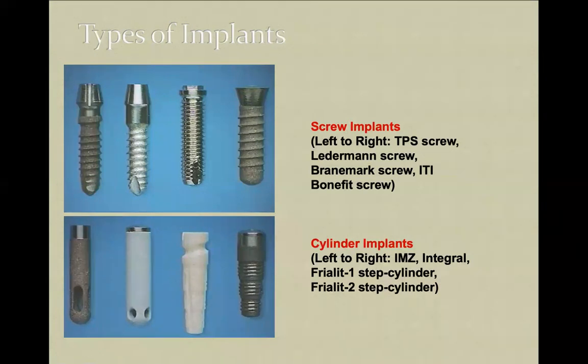And that is the key, because the narrower the implant is, the more mechanical problems might occur later on, like a fracture of the internal screw, or a fracture of the neck of the implant. So that kind of implant, the 3.0 diameter, is usually a single-step implant that does not have an internal screw and should be loaded at once.